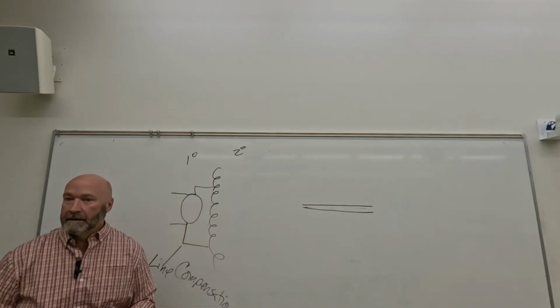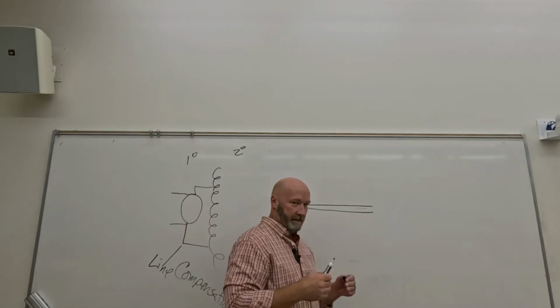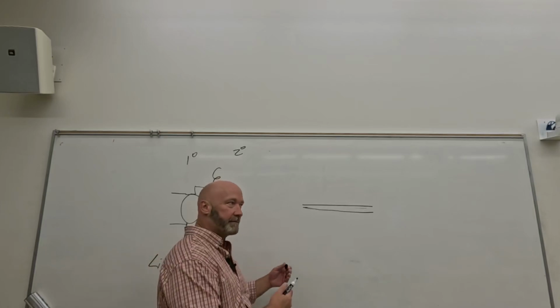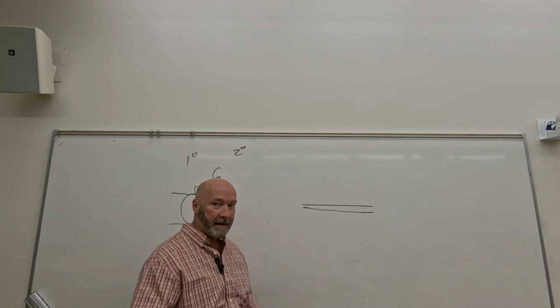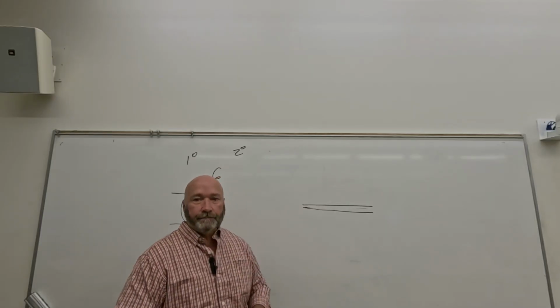Does that make sense? So it has to be radiolucent, and the more radiolucency it has, the better off it is, because if it's less radiolucent, we're going to have to expose the patient to more radiation. So it has to be highly radiolucent, and it has to be uniform thickness, right?